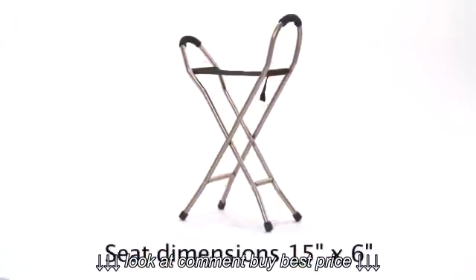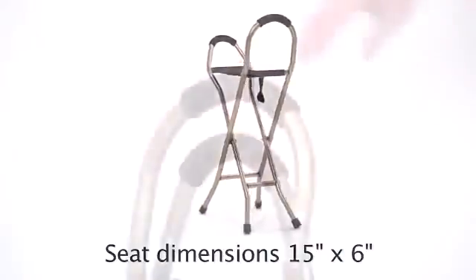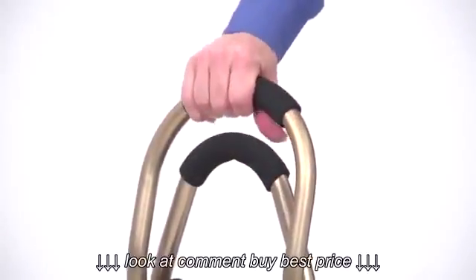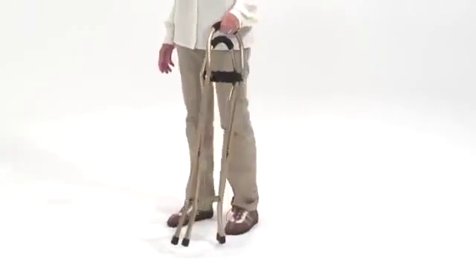When opened, this sling seat sits 22 inches from the floor to provide a comfortable seat for resting. The foam grip handles on both sides offer additional support to help the user sit and stand more easily.